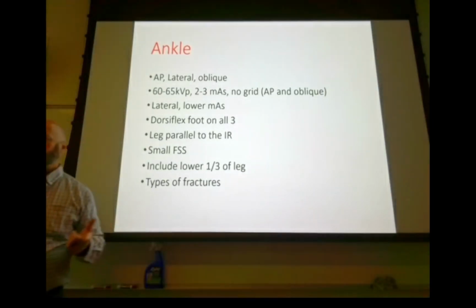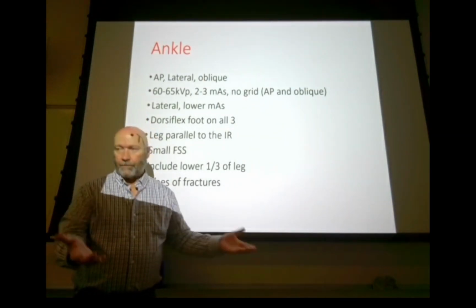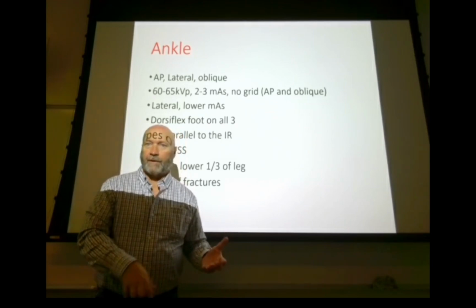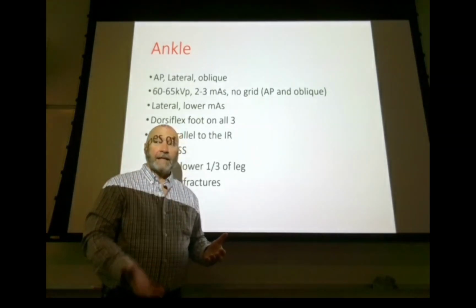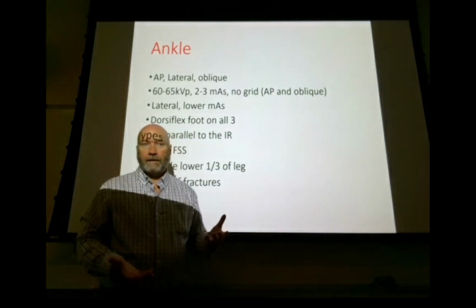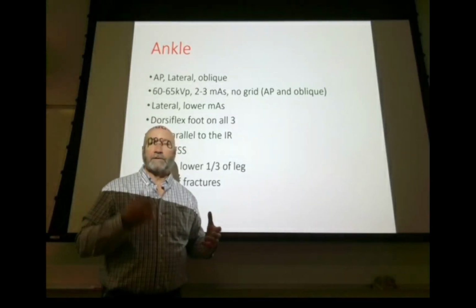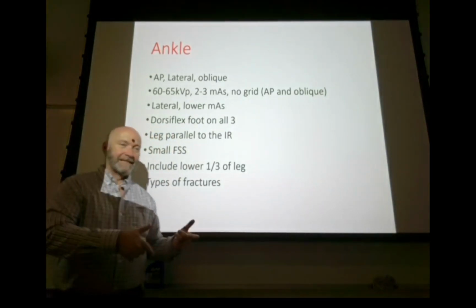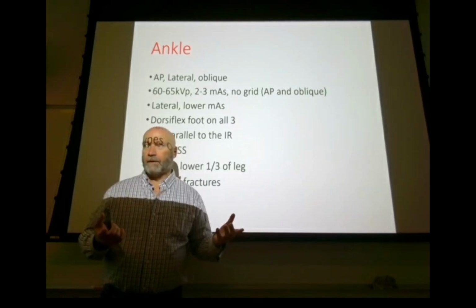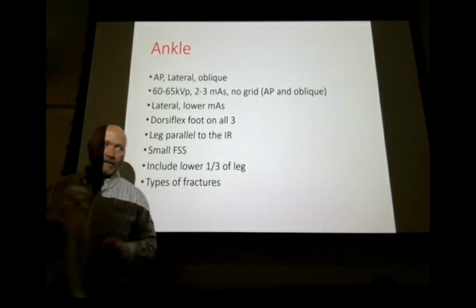If you're ever doing an ankle on a patient and you walk into the room, let's say you're doing tabletop, and you pick the leg up to put it on the image receptor, have the patient pick the leg up, and you see and hear and feel the foot dislocate. Most of the time, they can pick the leg up and it hurts, but it doesn't dislocate, and you certainly can't visualize it. But if you can see it, you pick the leg up and you feel a ka-thunk, and you possibly even hear it, then it's extremely unstable, and you have totally destroyed the syndesmosis.